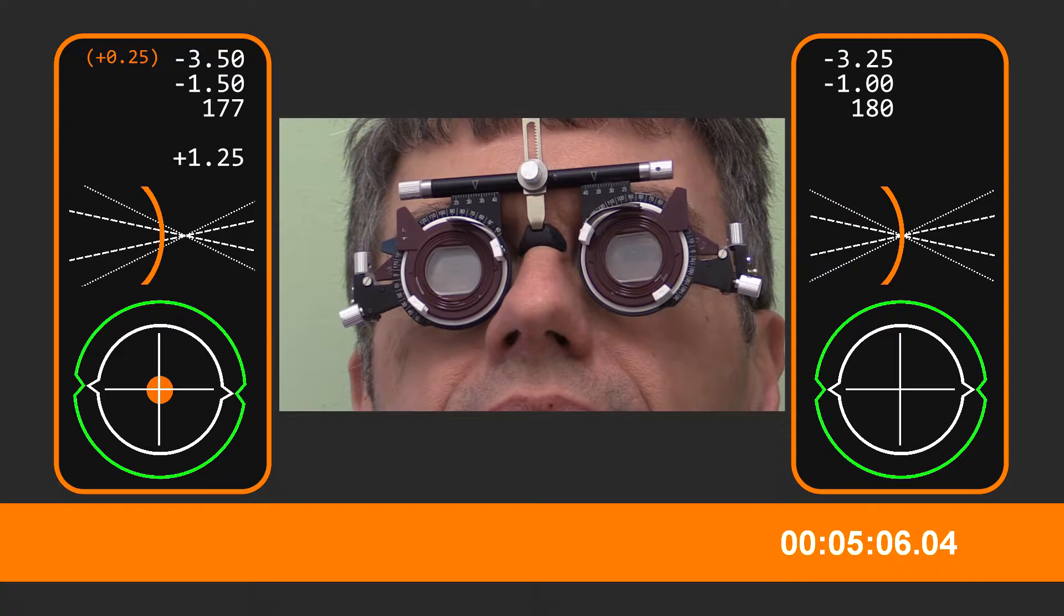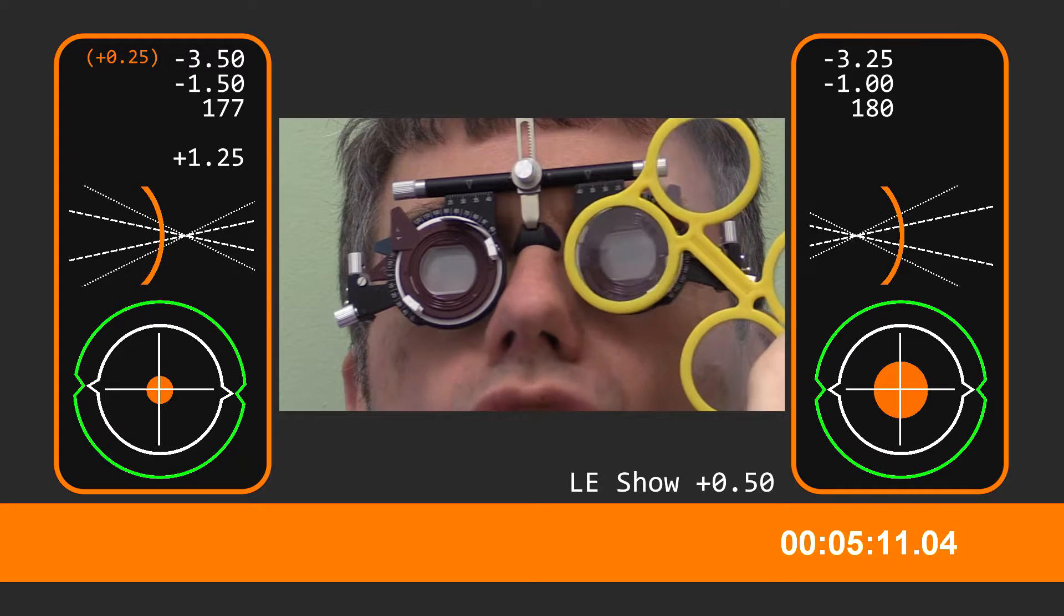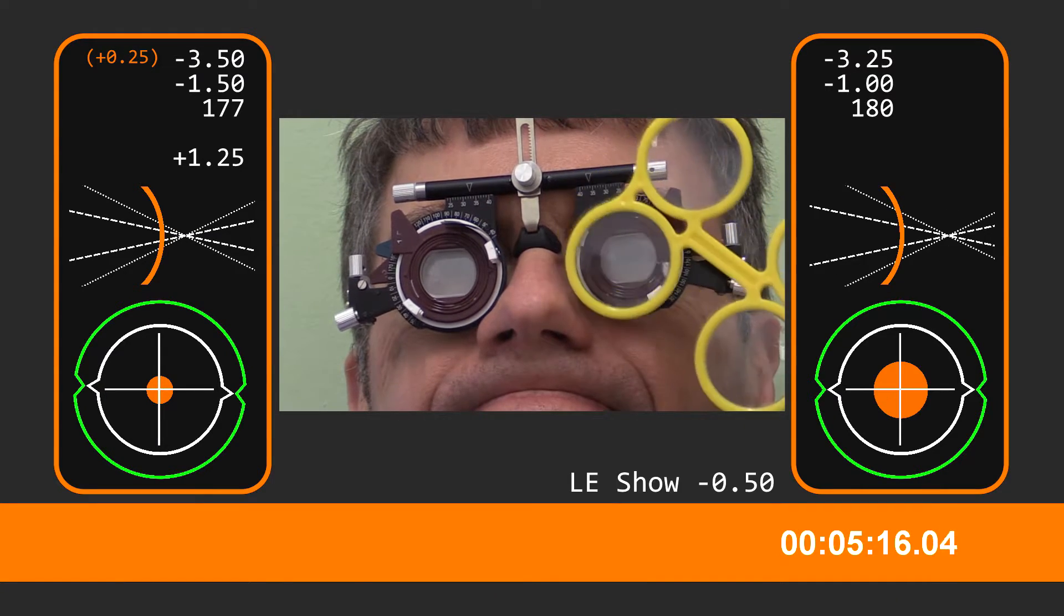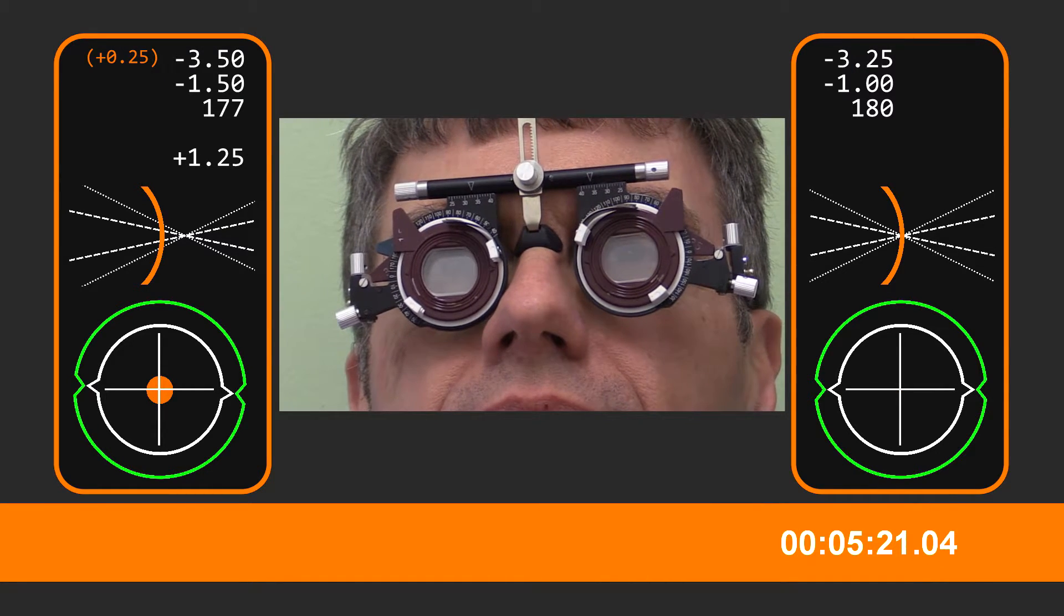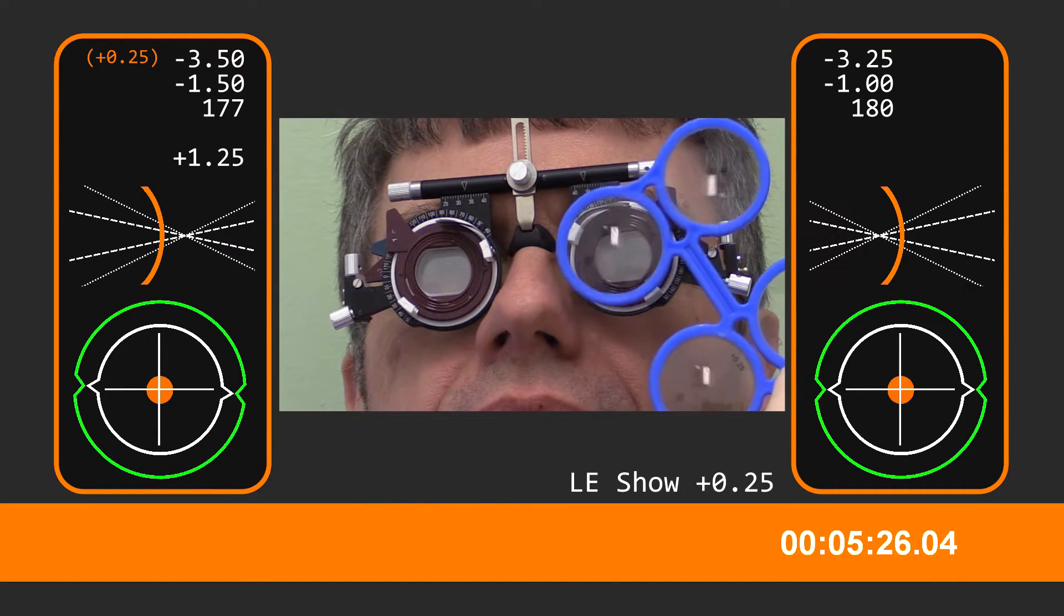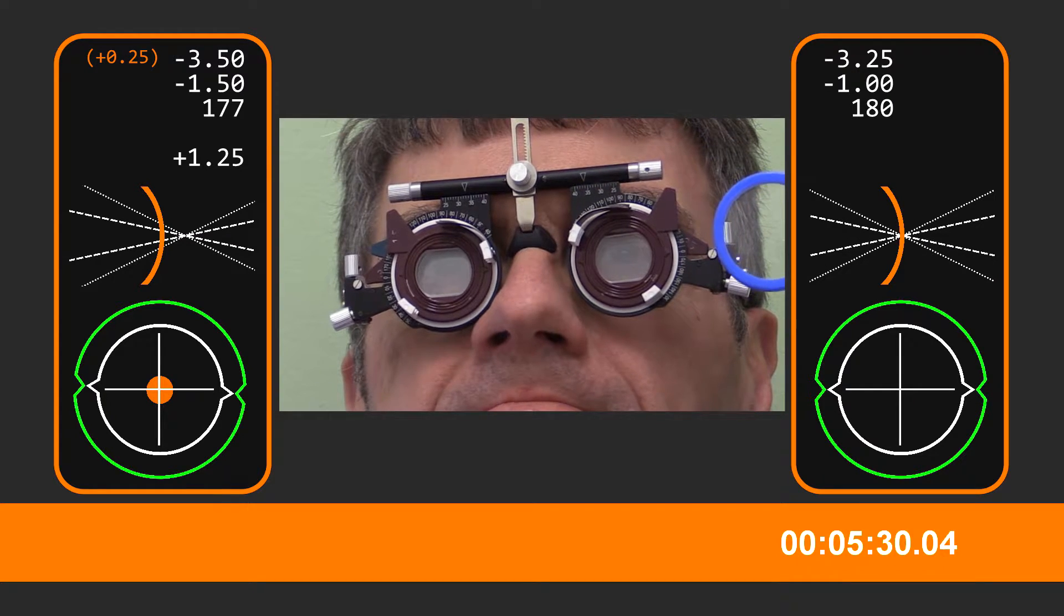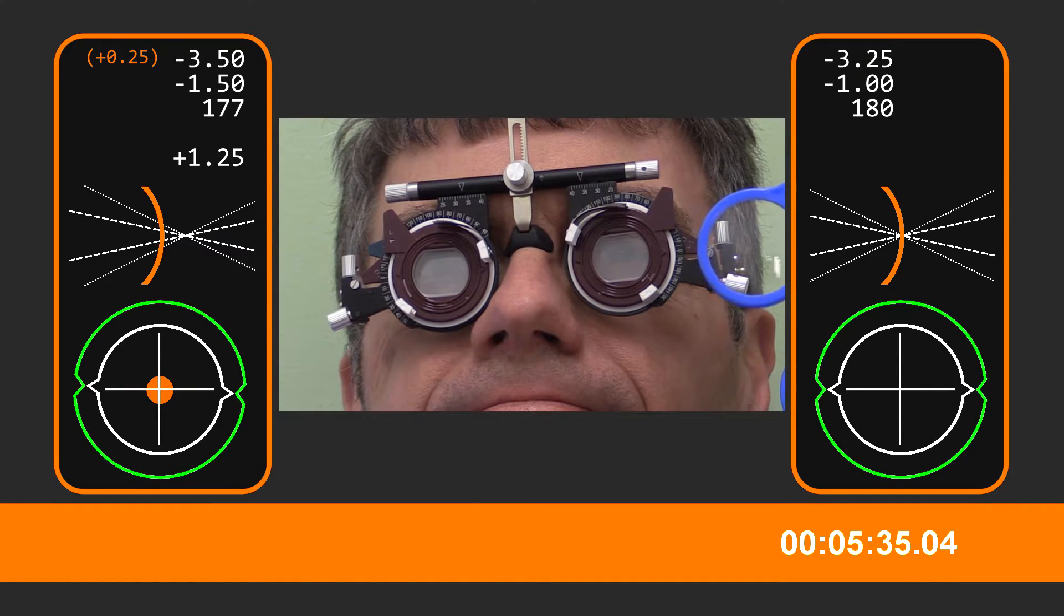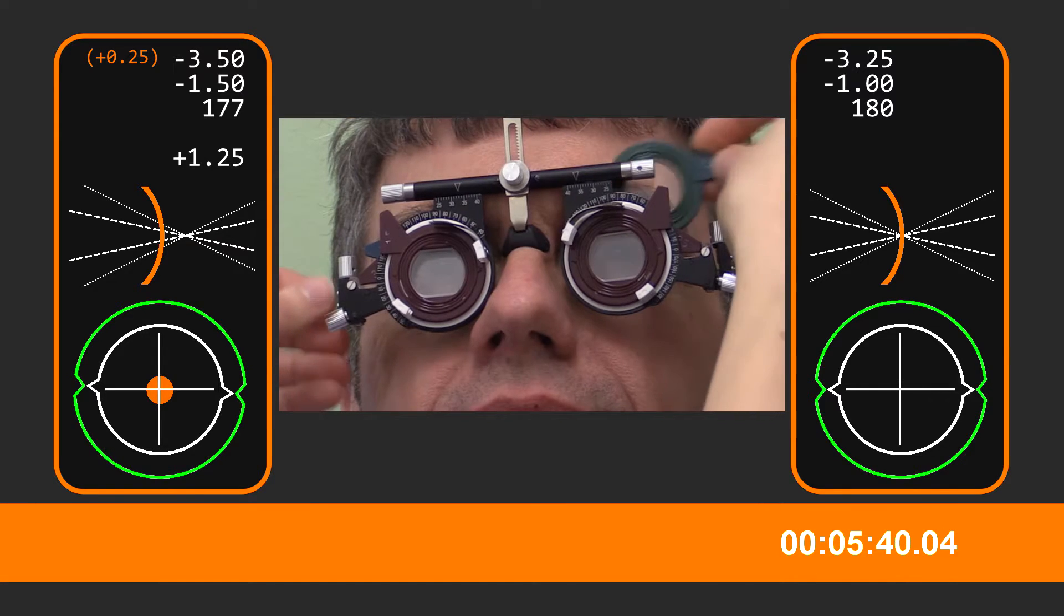And looking back at the chart. Are those letters on the chart the smallest that you can see, any clearer with or without? And clearer with or without? That's with. Worse with. Worse with. Worse with. Perfect. Okay. I'm going to make smaller changes here. Is it any clearer with that lens? The same or without? I'm seeing it in with. The same or without? Without.